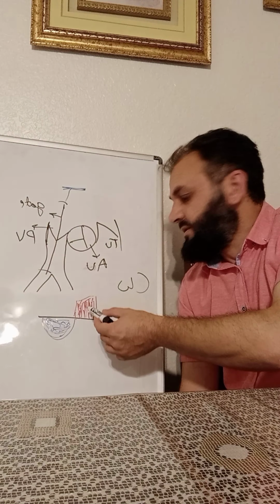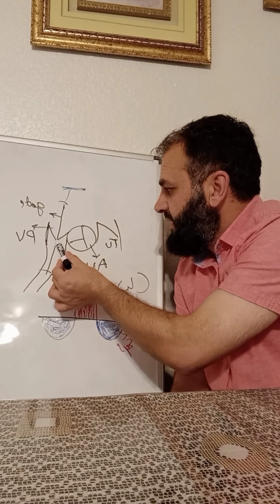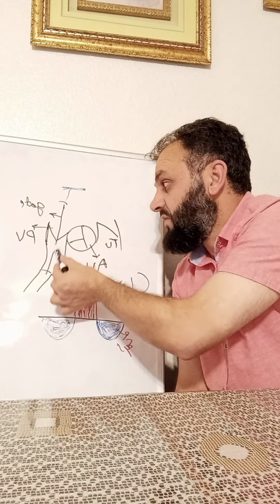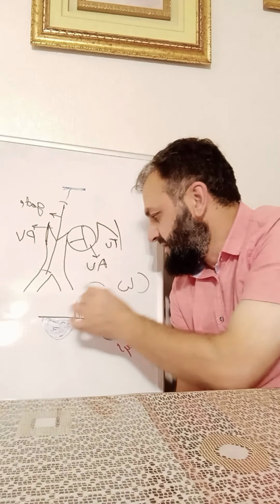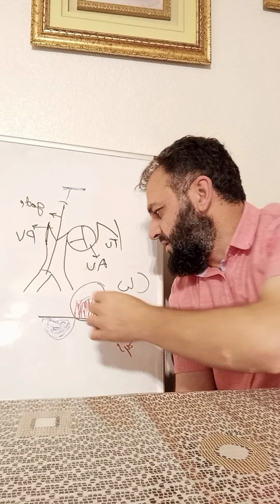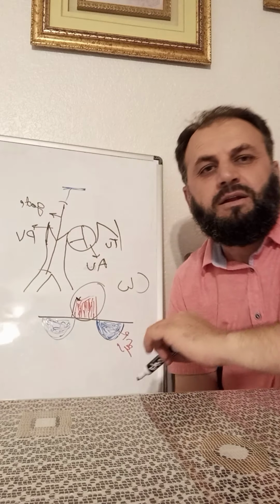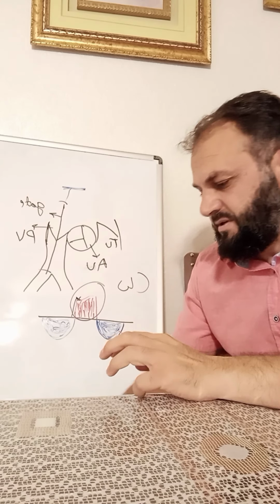Again, for the CW, if we are looking for any regurg, it's going to be when the valve is opening and leaking after, in the diastole. So in the diastole we see a regurg. The flow is coming from the pulmonary trunk back to the right ventricle. In that case, we will see this above the baseline. And we're going to look for the end-diastolic velocity, from the end of diastole all the way to the baseline. That will be our velocity for the regurg, or pulmonary insufficiency.